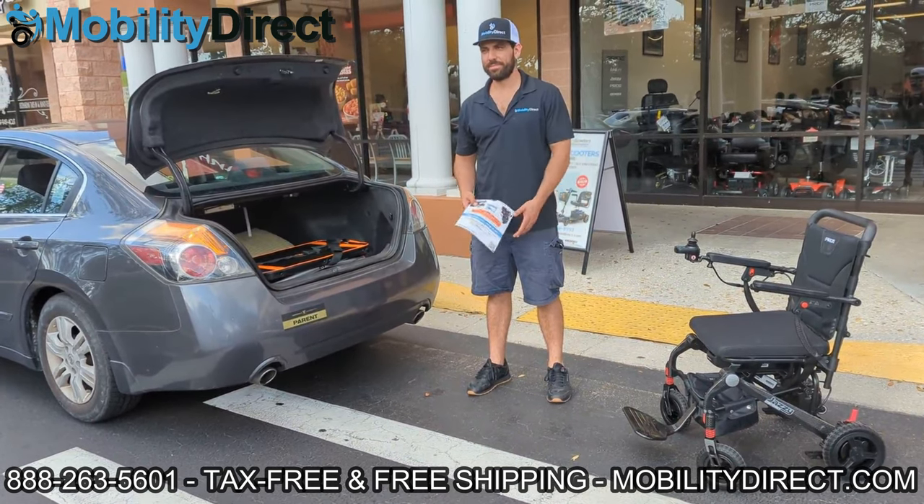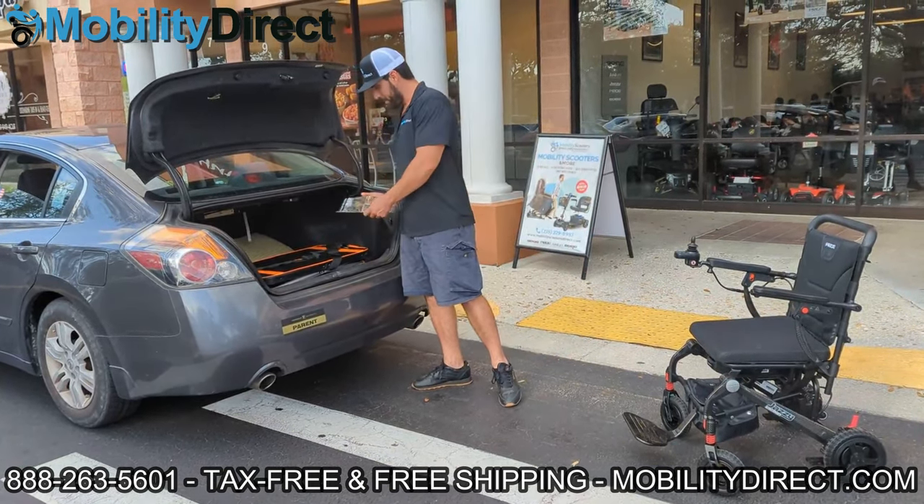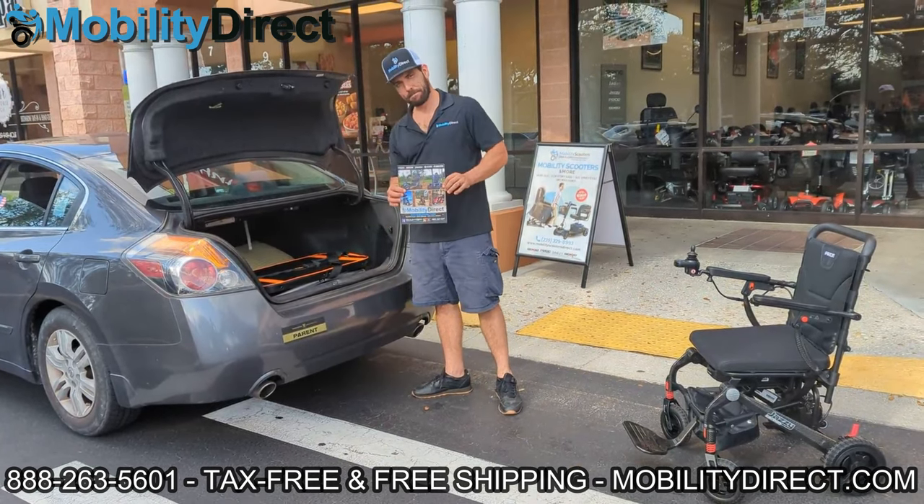Hello and welcome. In today's video we're going to show you the Golight portable mini lift used to lift power wheelchairs into the trunk of your car with ease.